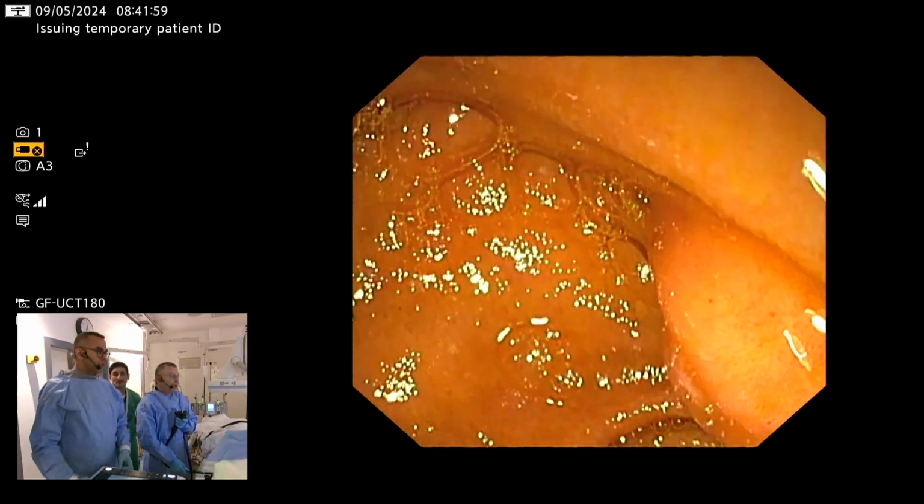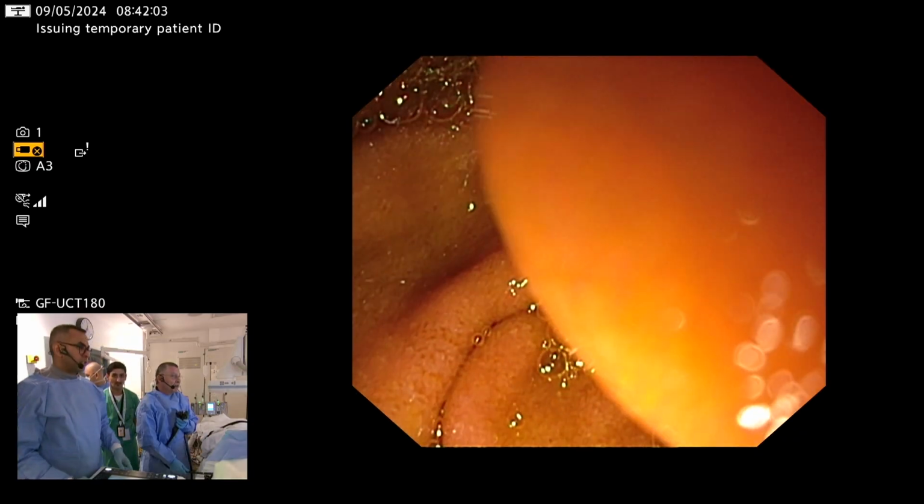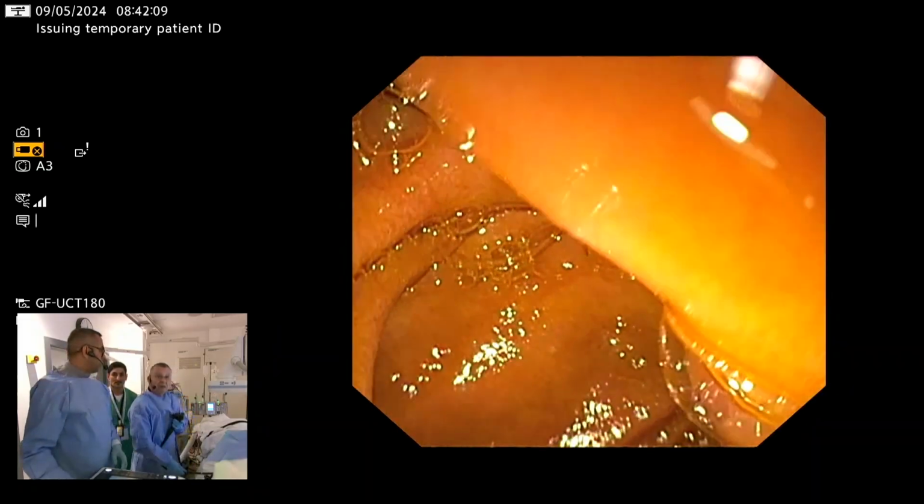For this case, we conclude that the physiological dilation of the common bile duct is due to cholecystectomy, supported by the lack of symptoms and the normal liver enzymes. Therefore, no intervention should be taken.